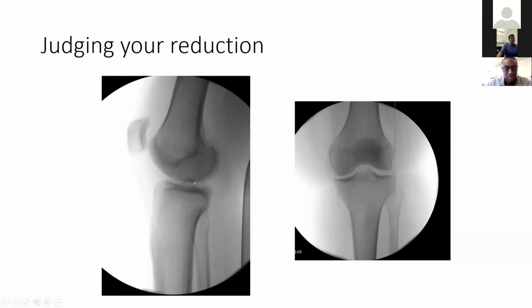Okay. So I did this view. This was the last plateau that I did with Dr. Marmer, and we did this view intentionally because it gives us a perfect view of the two joint surfaces. You can see them there in the medial and the flat lateral. But the X-ray is not a perfect lateral, and the way you can tell is that you have this little bit of difference there. If you have difference in the posterior condyles, that's rotational. If you have difference in the distal condyles, which there is none there, that's wig-wag or abduction-adduction. That's how you can fine tune your lateral images, just based on those two locations.